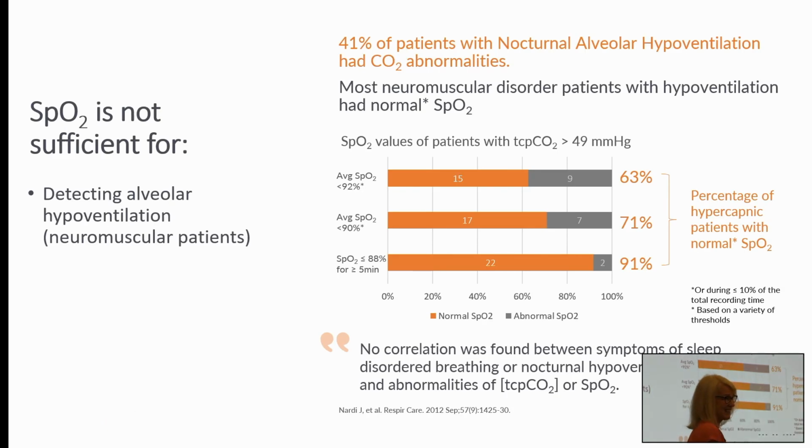So let's talk about some scenarios where oxygen saturation is going to come up short in showing a patient's full ventilatory status.